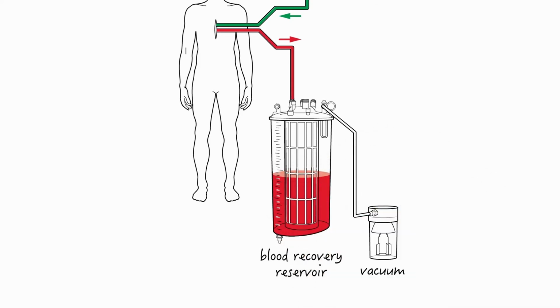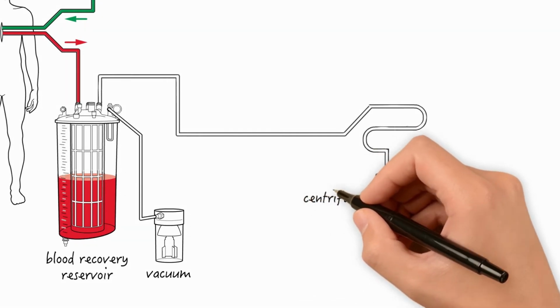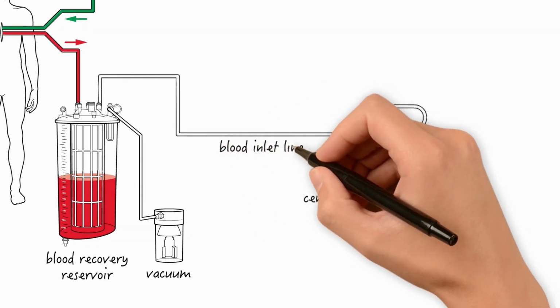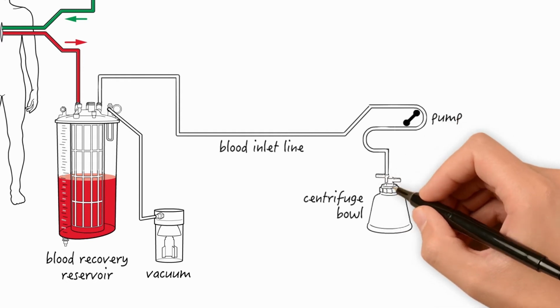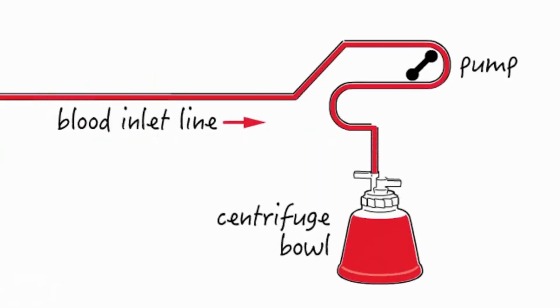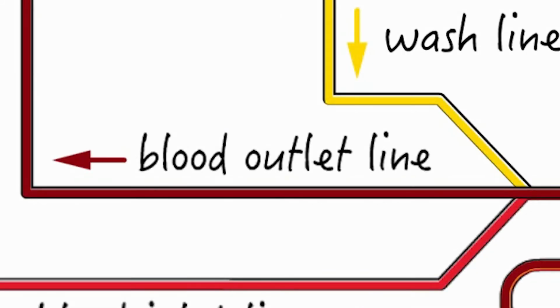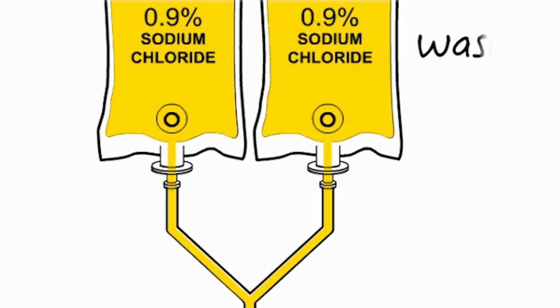Once enough blood has been collected, the wash set needs to be installed. The wash set consists of several elements: a modified Latham bowl, a pump loop and tubing organizer cartridge, the blood inlet line, the wash line, and the blood outlet line, a blood collection bag, and a waste bag. A bag of saline is also required.